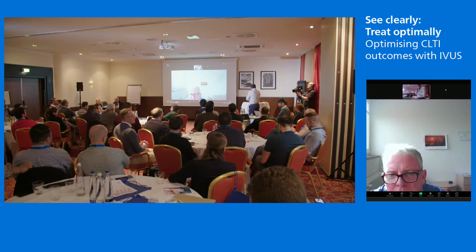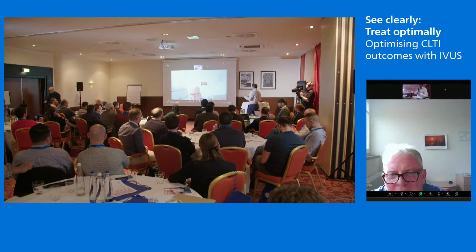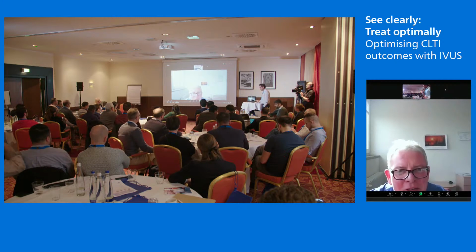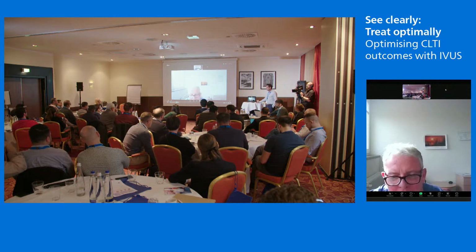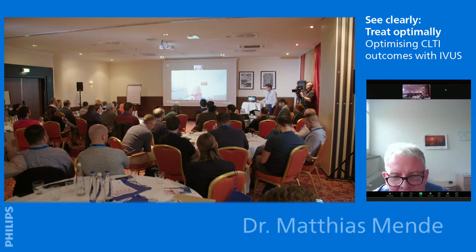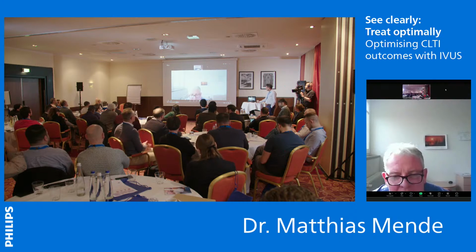How about capital equipment? Obviously the Phoenix is out of a box. It's so easy to use. You can put them on the shelf. Do you have to have a lot of capital equipment to use a laser? Yeah, unfortunately, there is quite big machinery coming with it. It uses up a bit of space in your cath lab, so mine is very restricted at the moment still, but we found a corner to park it.